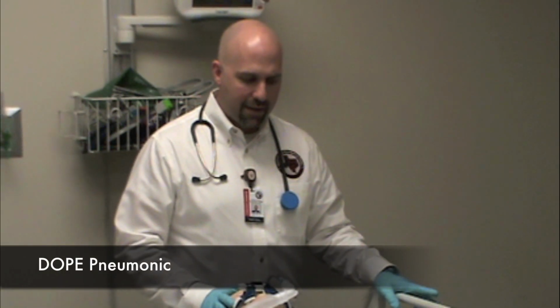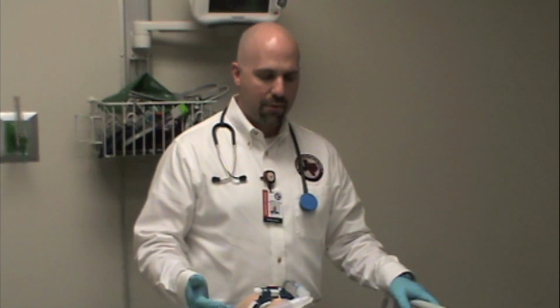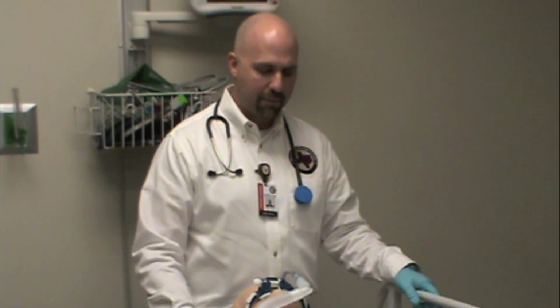I'm going to teach you guys an acronym called DOPE, and DOPE is a quick, down and dirty way to troubleshoot a ventilator problem. So the first thing that D stands for is dislodged. So if you have a ventilator alarm and you're worried that the tube might have gotten pulled, you might want to take your laryngoscope back out and take a look and make sure your tube's in the right spot.